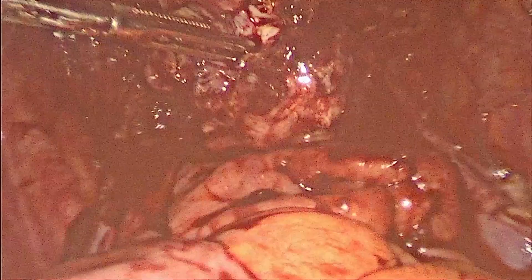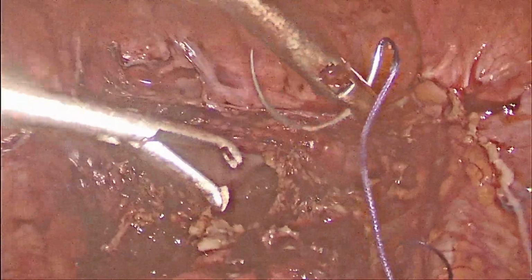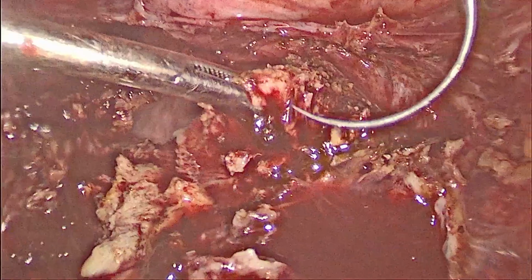Now almost complete excision of the adnexa of the right side is being performed. That is the taenia coli adhesion to the adnexa. So now this is the completion of hysterectomy and left salpingo-oophorectomy and a right side salpingectomy with right ovariotomy.